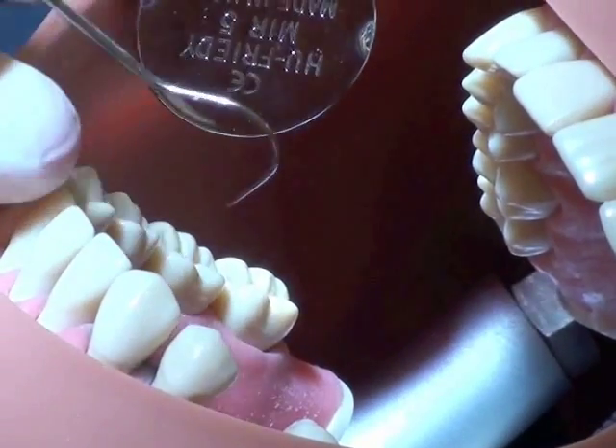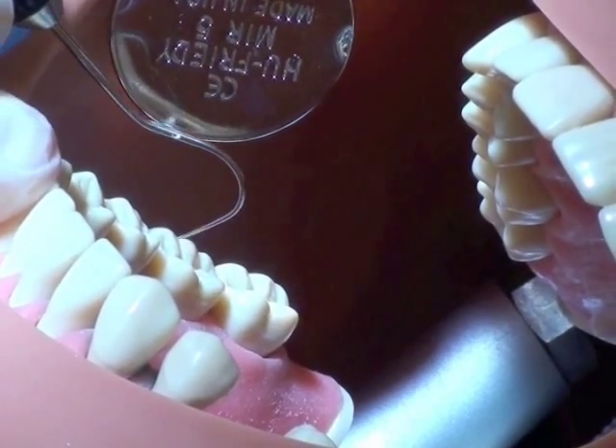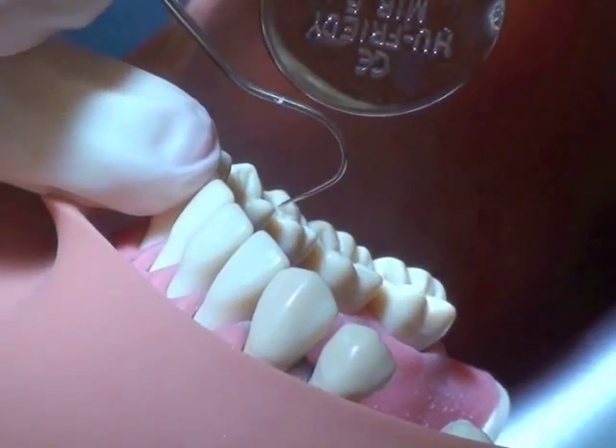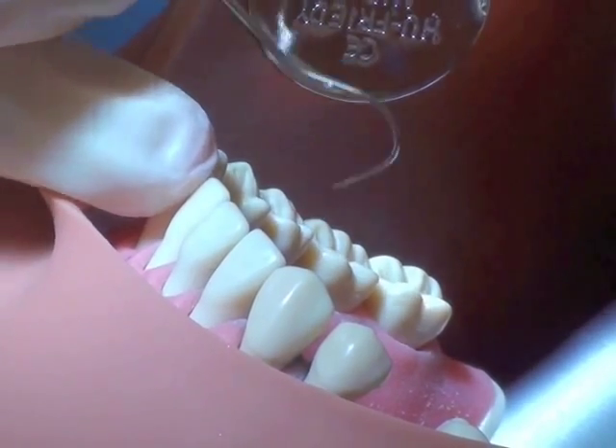If there are any existing restorations, now's the time to trace those margins to be sure that there are no discrepancies. You're going to be using a lot of visual examination of the teeth.